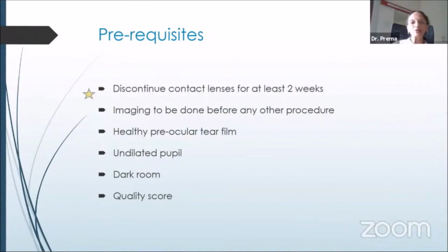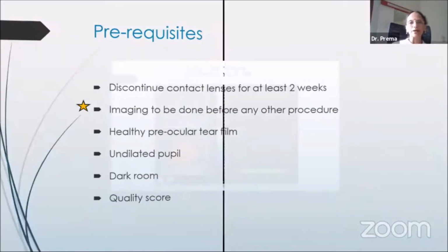But I would just like to emphasize the importance of making these measurements before the ocular surface is disturbed by any drops or any other procedure. Like any diagnostic tool, the reliability of the measurements depends on the attention we pay to these little details.